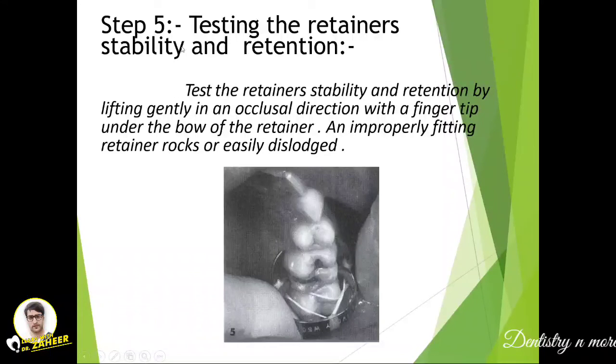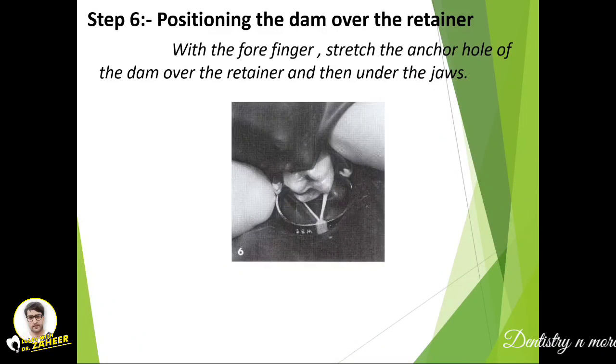Test the retainer stability by gently lifting it in an occlusal direction with a fingertip under the bow. An improperly fitting retainer will shake or be easily dislodged. Then position the dam over the retainer: with the forefinger, stretch the corresponding hole of the dam over the retainer so it encircles the tooth and lies against the rubber dam sheet.